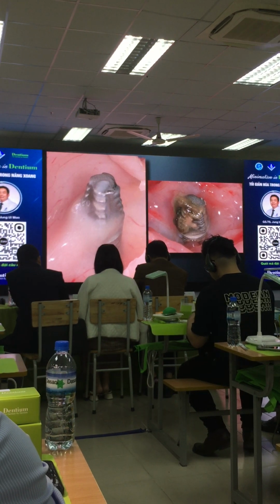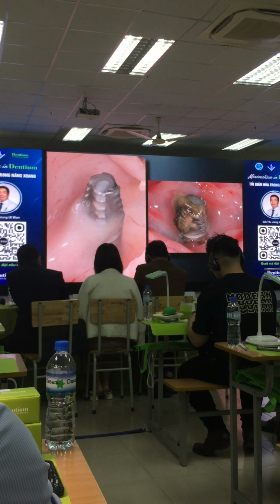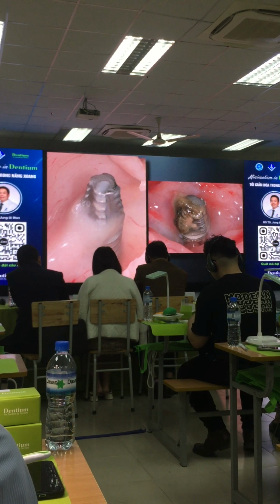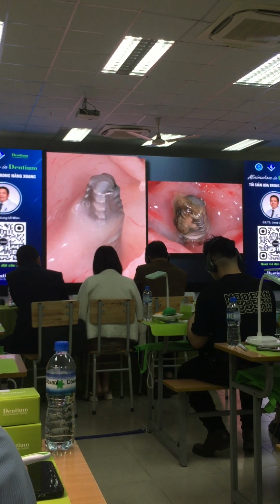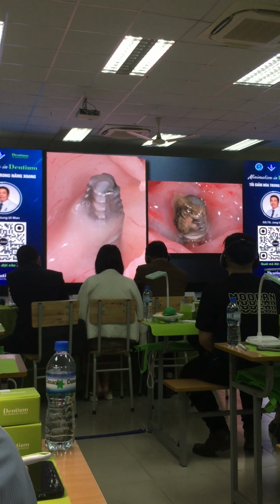Crestal approach requires simultaneous placement of implant protruding into the sinus cavity to tent the sinus membrane and create an adequate space for blood clot formation. However, it is not always possible and may not result in a sufficient amount of new bone formation.